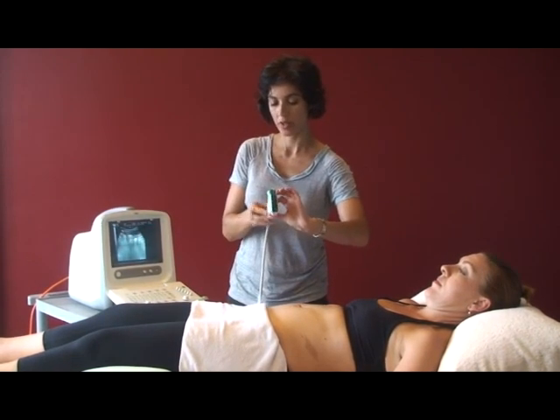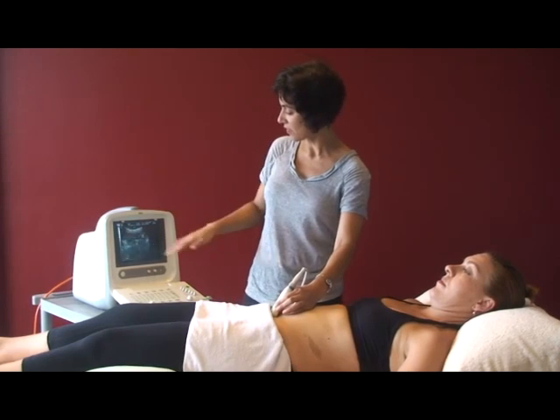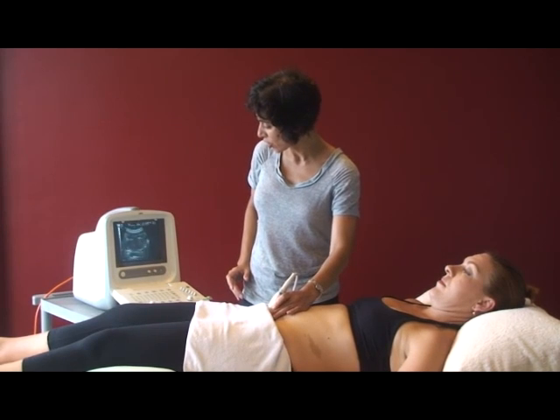Make sure that the dot on the transducer head lines up with the dot on the screen, so that your client's left is the left on the screen. Then bring the transducer head just down to the pubic line.